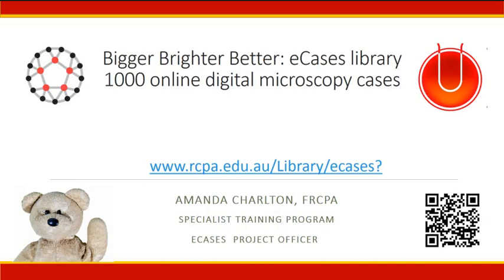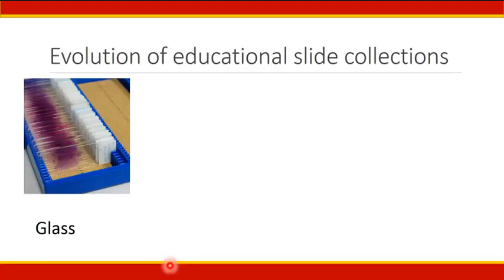I'm an anatomical pathologist, and today I'm sharing a new online library of over 1,000 educational surgical pathology and virtual microscopy cases. Educational slide collections are the backbone of both registrar and continuing medical education in pathology. We've all used glass slide collections. Who has boxes of workshop slides languishing and fading in the back of cupboards? I know I do.